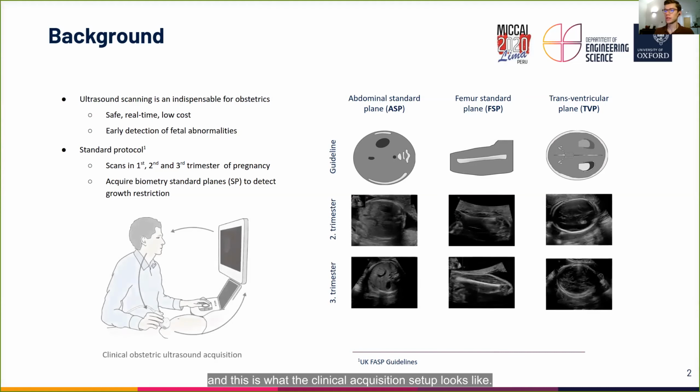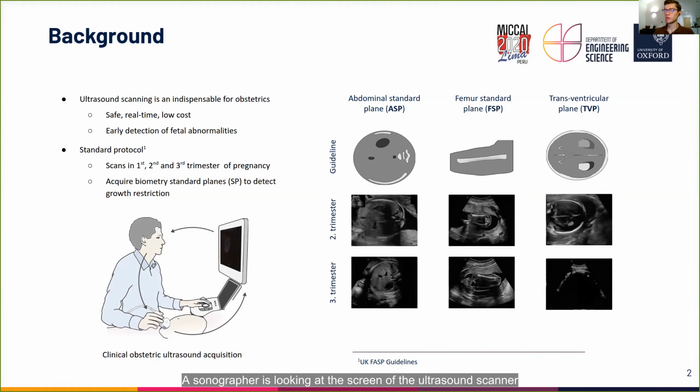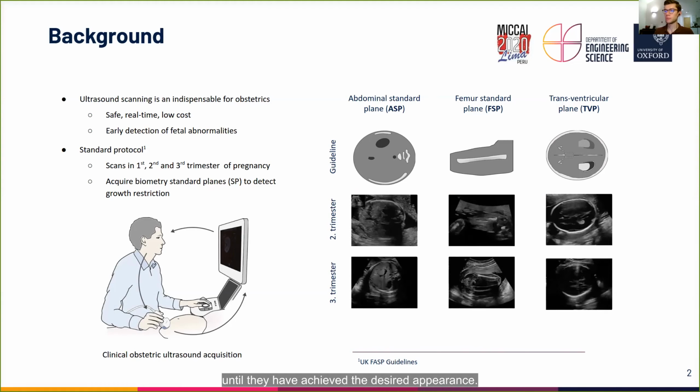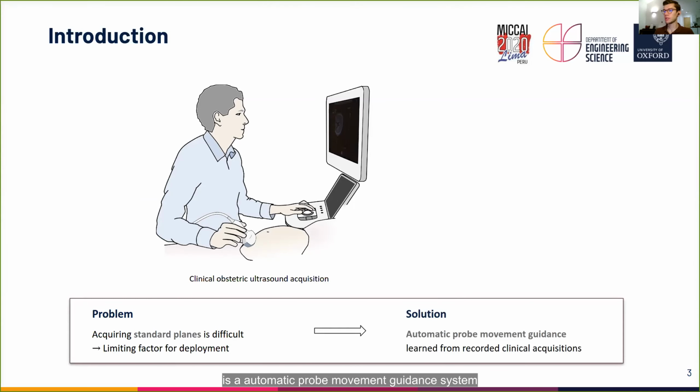And this is what the clinical acquisition setup looks like. A sonographer is looking at the screen of the ultrasound scanner and is manipulating the probe until they have achieved the desired appearance. The problem that we are facing is that acquiring standard planes is difficult, and therefore often the limiting factor in deployment.